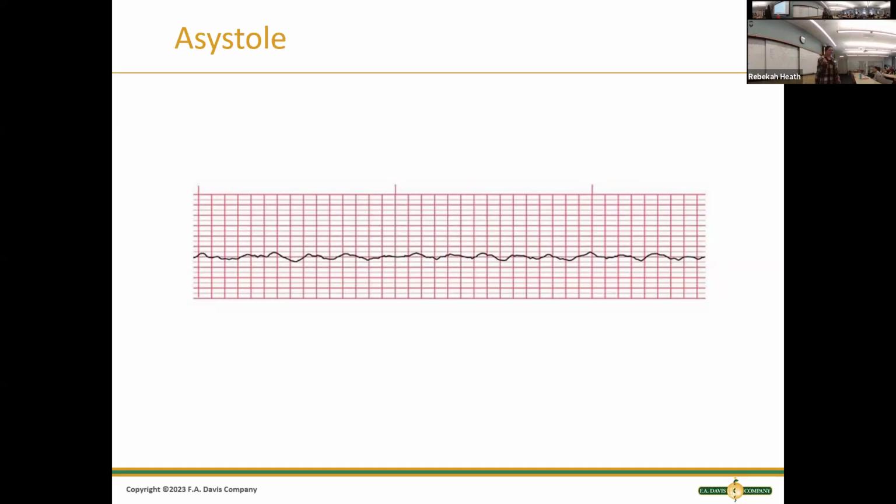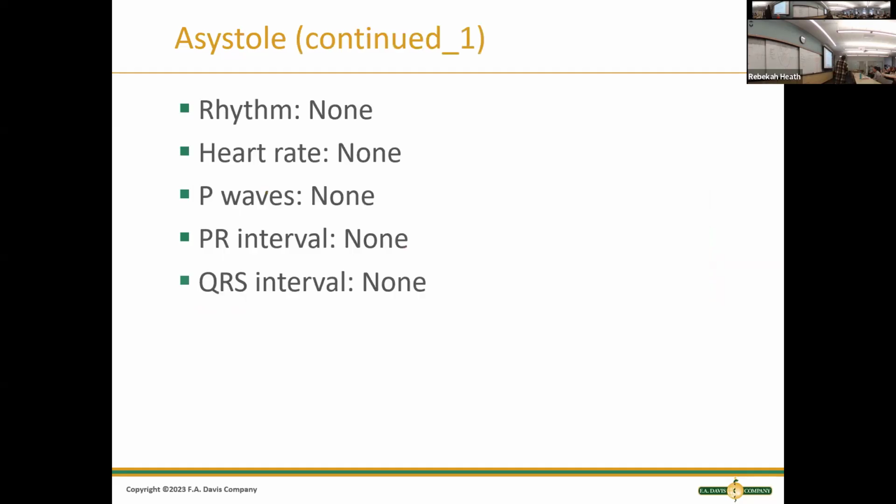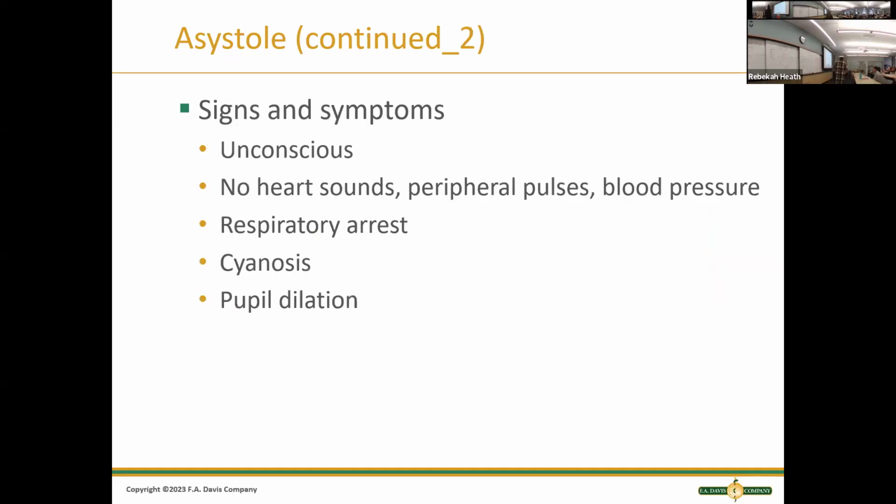Asystole doesn't look like the TV shows where it's this beautiful flat line that does nothing. That's not what it looks like in real life. It will look like this. Okay, asystole, they're dead, right? Their heart's not beating. We're going to do CPR, see if we can help bring them back a little bit.